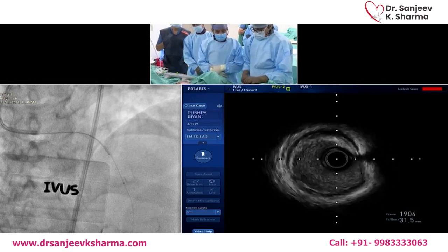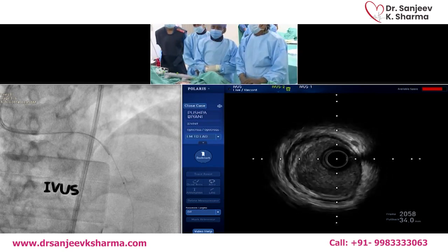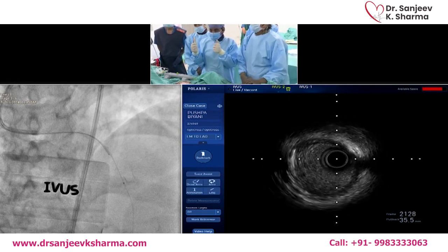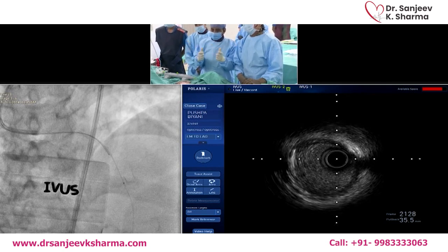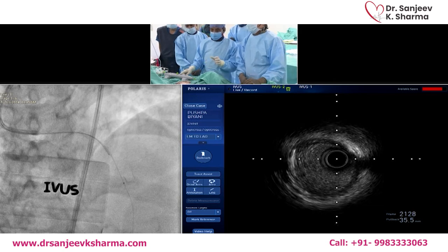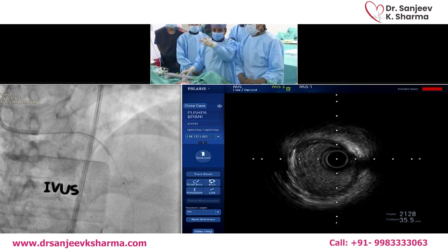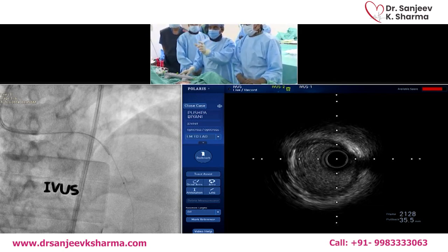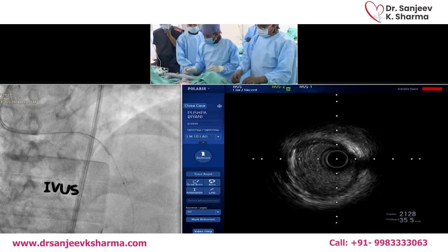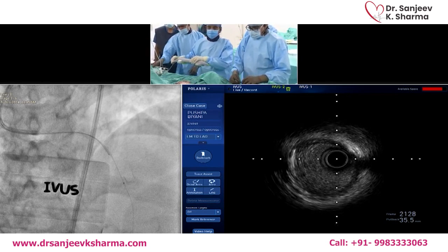We thought with that strategy, and maybe Roxana can make a comment, because everywhere else we have heard while we are doing it, that we are planning to do a high pressure balloon of the circumflex, and for the LAD we are doing the orbital with 80,000, maybe decide 120 because of the large vessel, followed by maybe a cutting balloon at the angle, because that circular calcium is a short one, and then decide with the mini crush technique. That's our approach. That's what we have been teaching everyone. While you have a discussion, we are ready to start. Good. So push and pull.